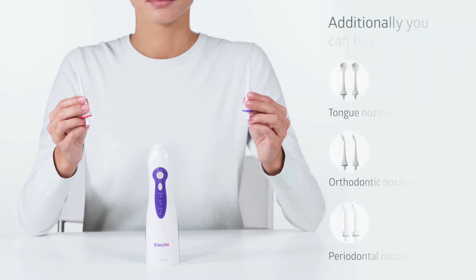The WI 911 Irrigator comes complete with two standard nozzles. Additionally, you can acquire orthodontic nozzles for braces, tongue-cleaning nozzles, and periodontal nozzles.